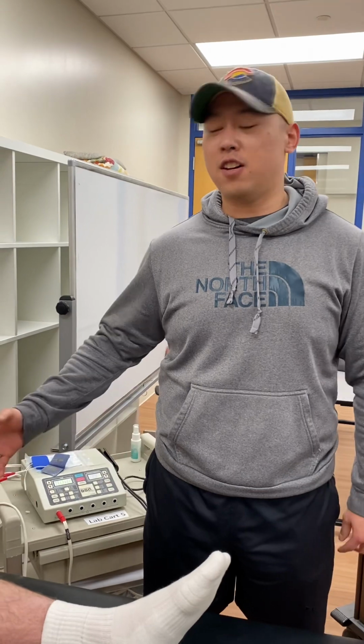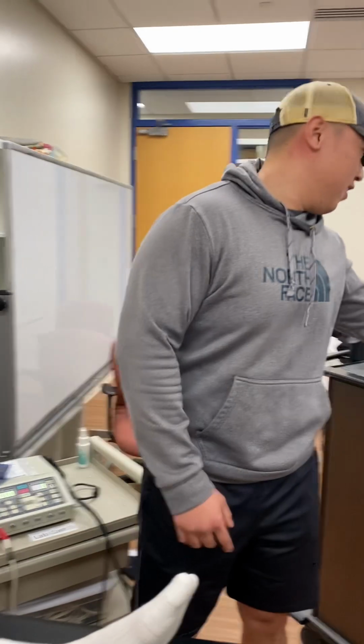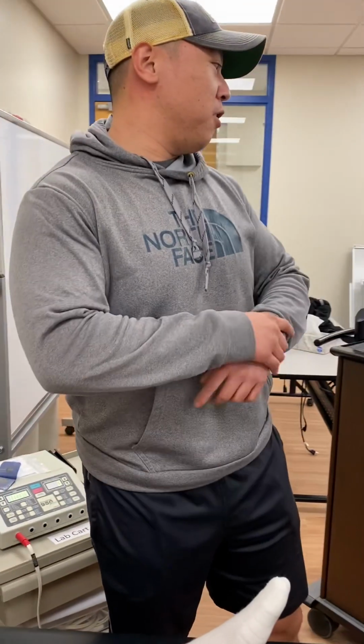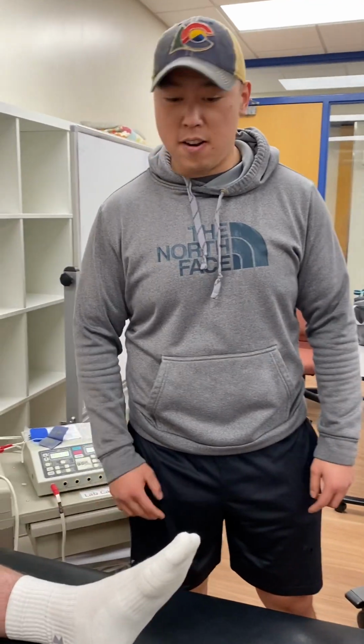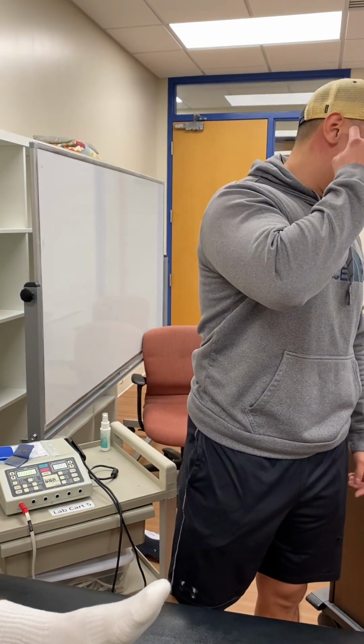So what that means is a 1 to 3 ratio. So it's going to be 10 seconds of contractions, or 10 seconds this machine is going to be on, and then 30 seconds of rest where there's just a lack of estim basically. The reason why we're doing this, the proposed mechanism of action, is we're trying to get that quad to fire more effectively and get rid of that extensor lag.